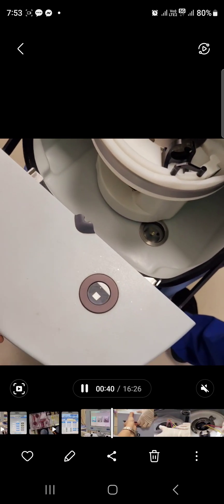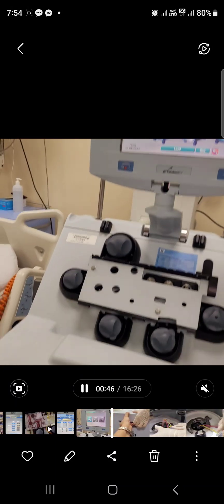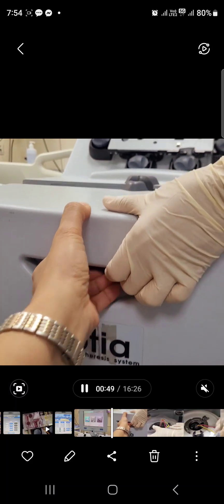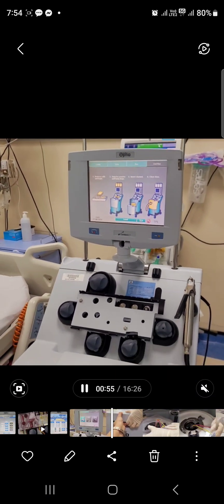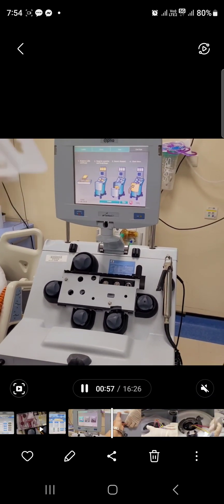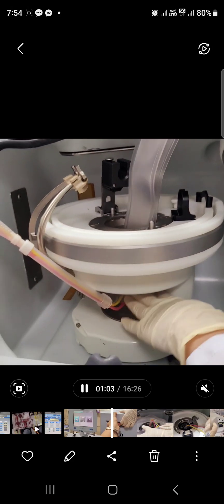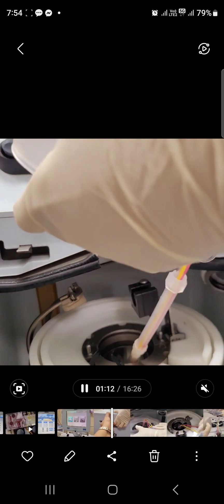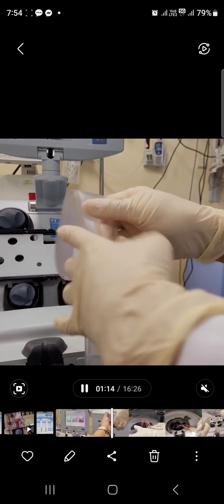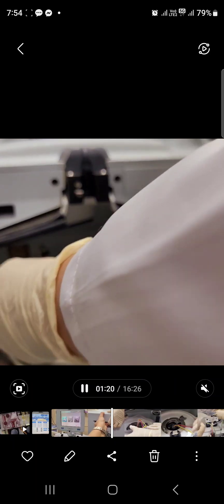We are going to set up the machine. In this procedure, we tried to set up from bottom to top. This set will be inserted from the bottom of the centrifuge, then up to the top. This set is divided into two colors: yellow and red. Remember, red is for your right hand, so do not confuse yourself.